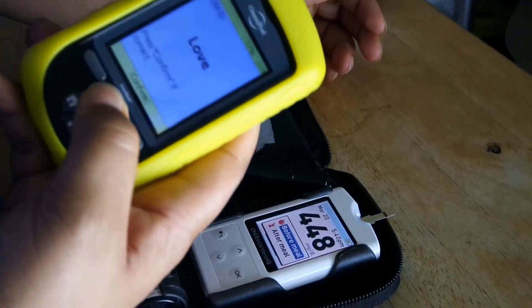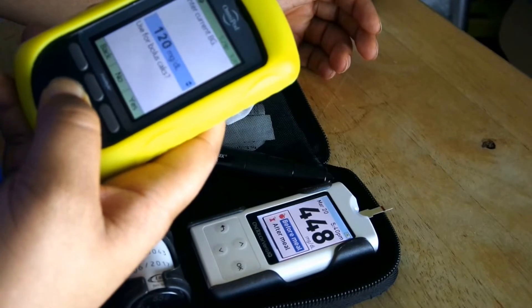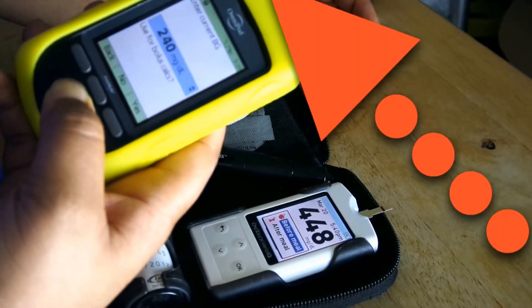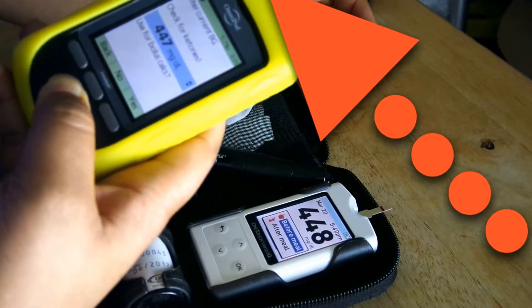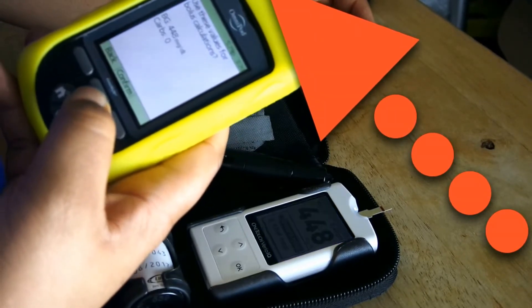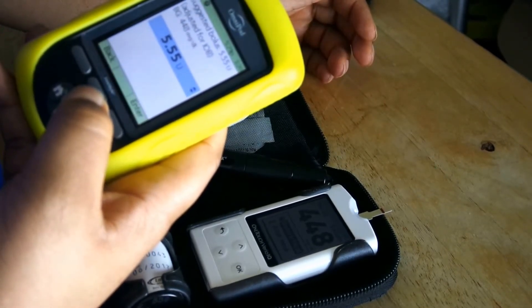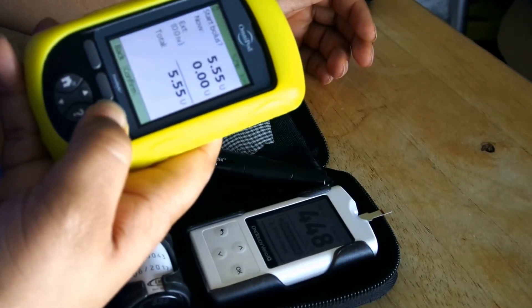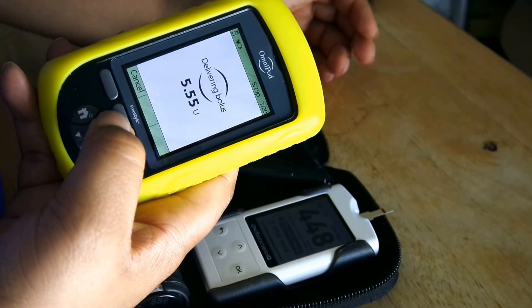So I take my PDM, hit confirm, home, bolus, and scroll up to 448. I'm still going. Then since I wasn't eating, I hit no and hit confirm, and it says 5.55 units according to my settings will bring my sugar down. So then I just go through and hit confirm.